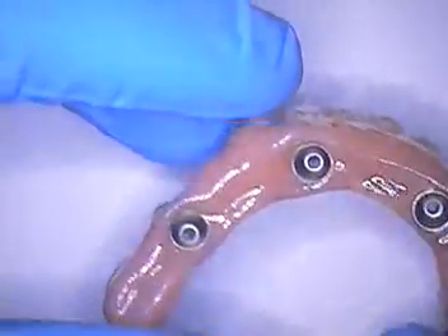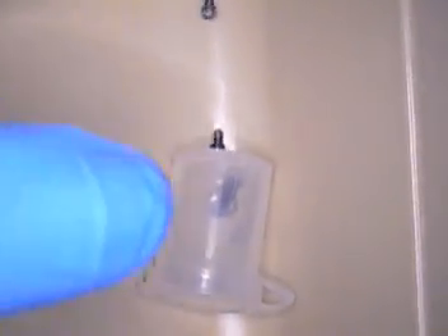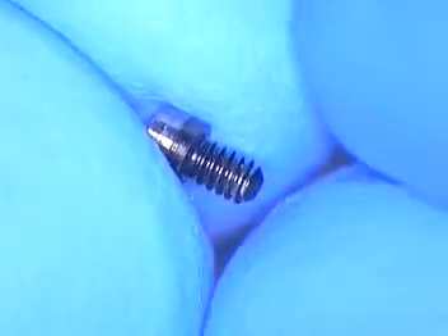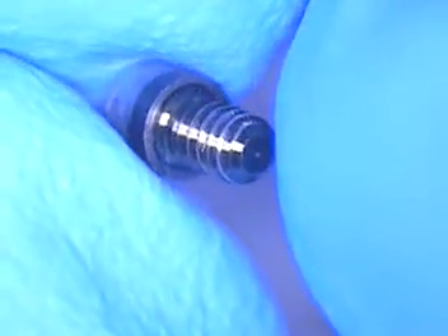First thing I'm going to do is put this aside and take out the prosthetic screws that are returned with the case. I would highly suggest that you do not use the screws the labs give you unless they're pristine — unless they come in a container where they're all brand new. If you look at the working screws along the way, you'll find that sometimes they get embedded with wax and particles, and also they get nicked when they're in a lab. If you start using screws that have aberrations or nicks on them, you're going to transfer that onto the patient's implant.